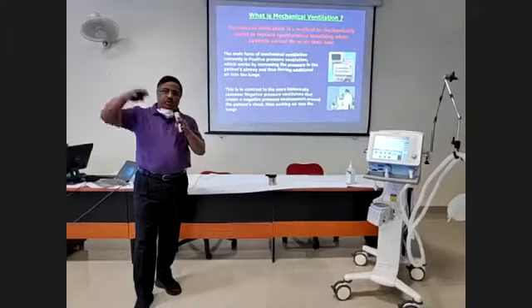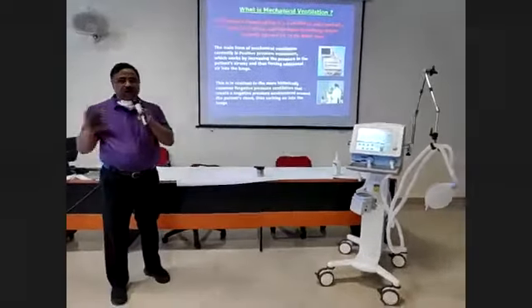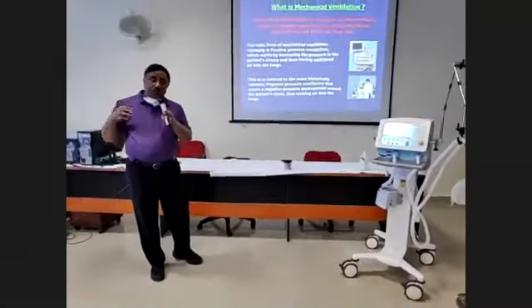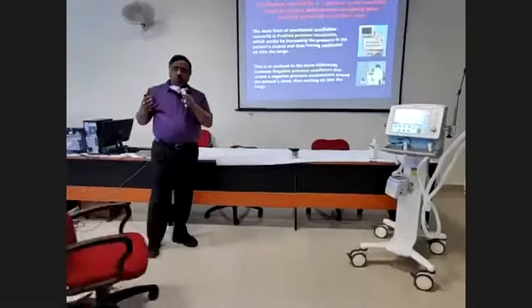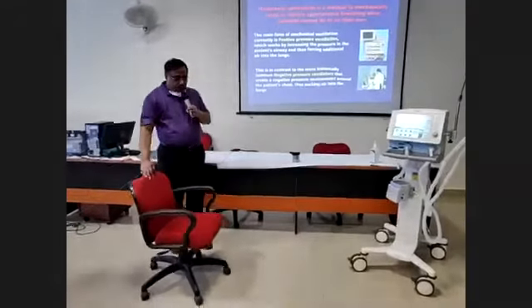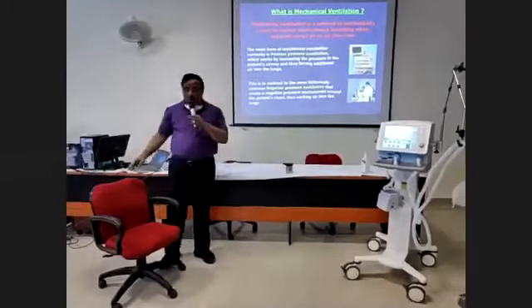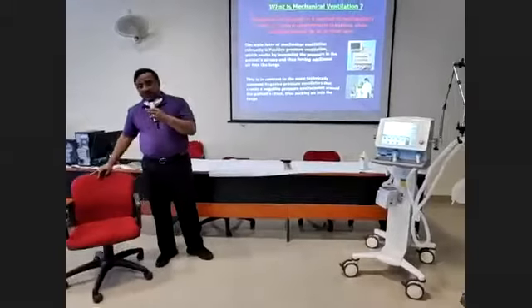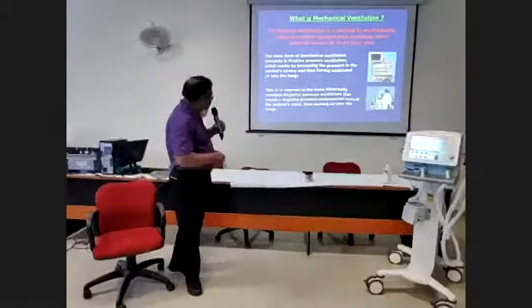Chamber used to create a negative pressure, and that used to be ventilation. But now those eras are gone. I hope that in future the thing is going to come back. I do not know, but it may come back sometime later on this technology. And hopefully in another 10-15 years, Indians may come up with a negative pressure ventilator from India.